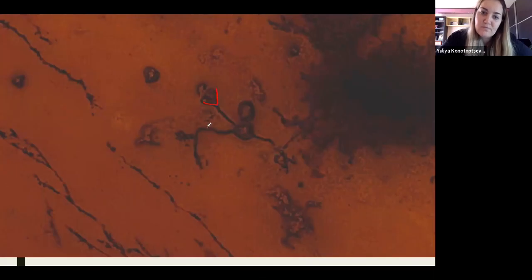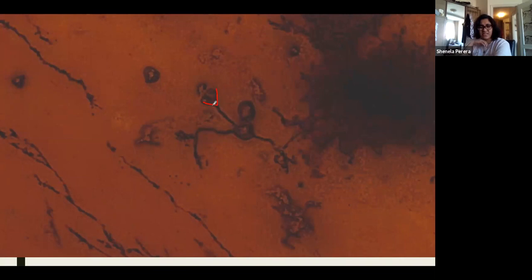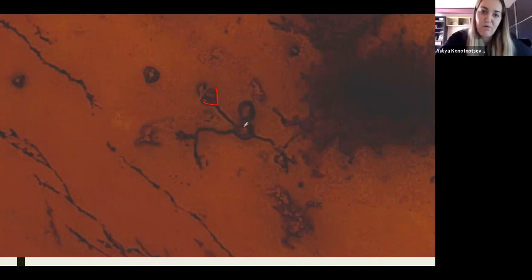What do you think this is? The dendritic claw. Yes, this is a granule cell, and this is the dendritic claw right here. You can see 3 dendrites are visible, right? Typically it's 3 to 4 dendrites, 4 to 5, but at the end, you should always see a dendritic claw.